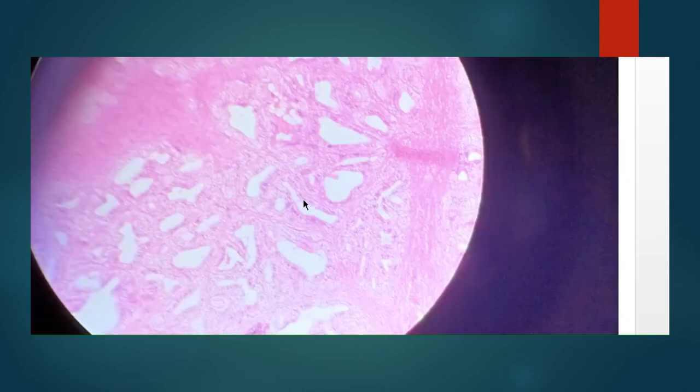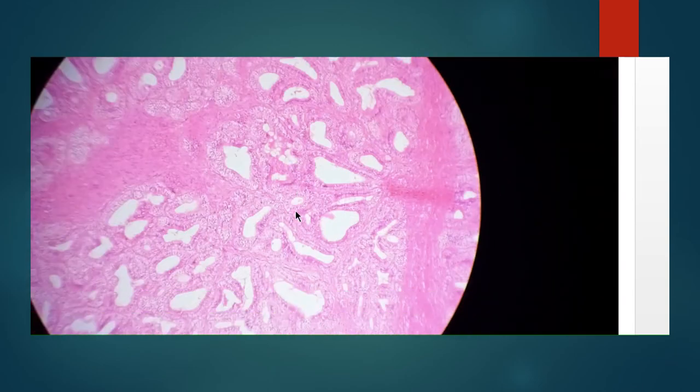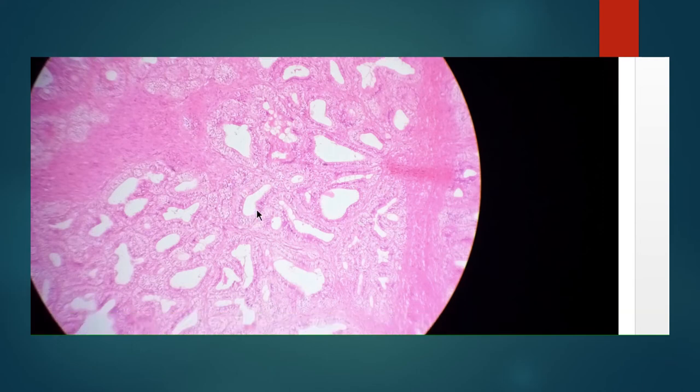And here you can identify fibrofatty tissue, fibromuscular glandular tissue. This is nothing but your prostate. These are the muscular fibrous part, and these are the glandular part. Some smooth muscles can also be seen. Fibromusculoglandular tissue, that is nothing but your prostate slide.